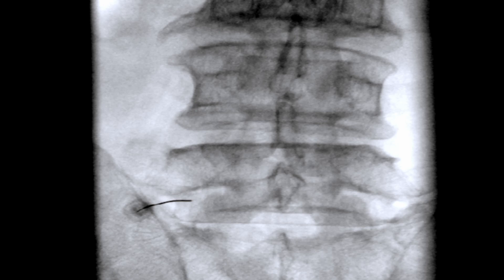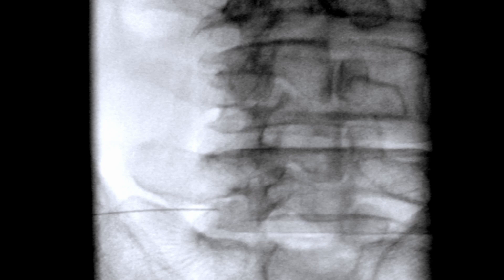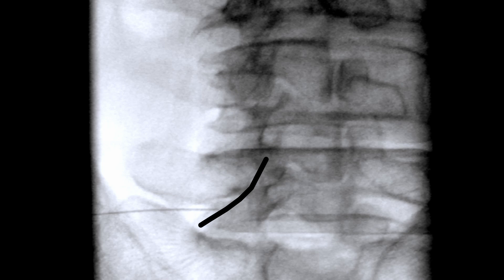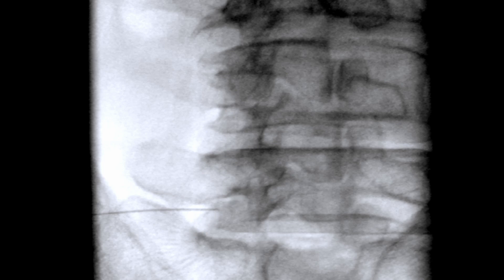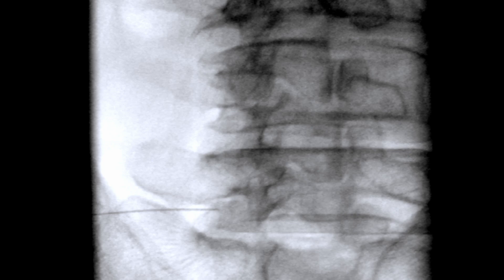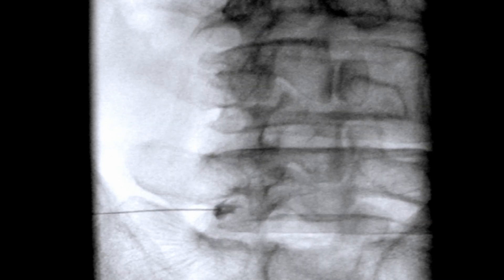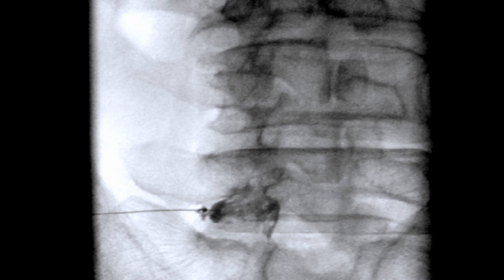Upon switching to the contralateral oblique image, it's apparent that the needle tip is significantly distanced from the inferior border of the pedicle. At this point, I envision an imaginary line depicting the nerve root. The needle traverses the central area of the intervertebral foramen, and the contact point between the nerve root and the needle should be positioned laterally from the lateral border of the pedicle. I cautiously advance the needle, keeping the image of the nerve root and the contact point in mind while continuously communicating with the patient. The resultant contrast pattern is typical in these cases, with the contrast extending more into the intervertebral foramen and posterior epidural space.